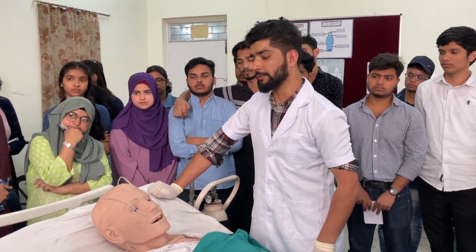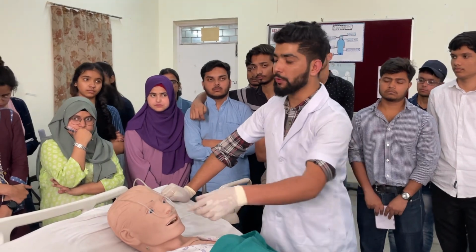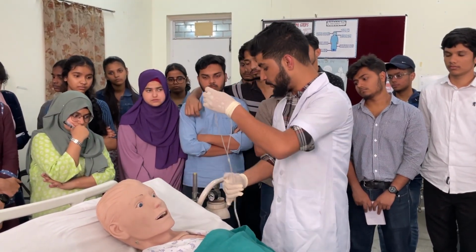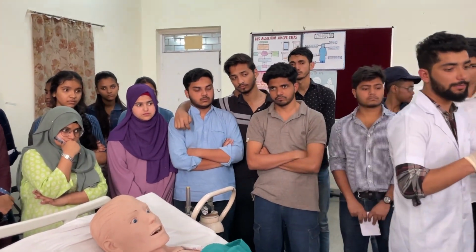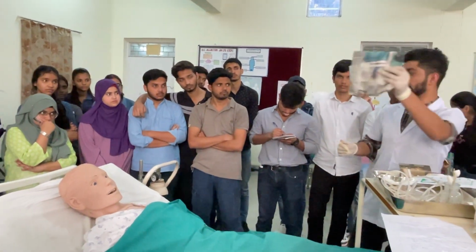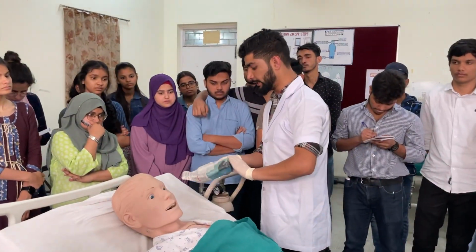Got it? This is a very important procedure. After that, we have to remove this nasal prong. Okay, this was the procedure of nasal prong. Now we are discussing nasal mask. Same as nasal prong. Same is the procedure.